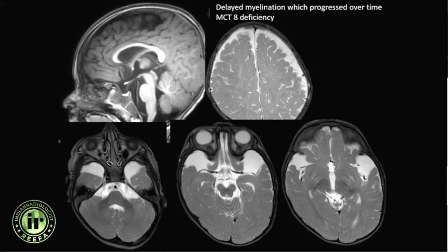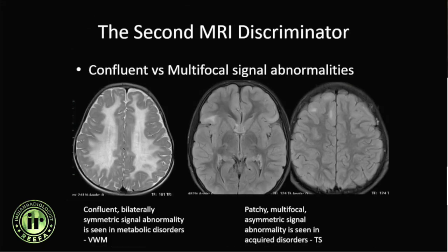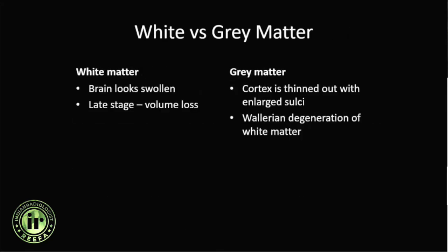This delayed myelination which progressed over time was seen in a patient with MCT8 deficiency. The second MRI discriminator is whether the MRI findings are confluent and bilaterally symmetrical versus multifocal and bilaterally asymmetric. Confluent, bilaterally symmetrical signal abnormalities are seen in metabolic disorders, whereas patchy, multifocal, asymmetric signal abnormalities suggest other acquired disorders like tuberous sclerosis or ADEM.